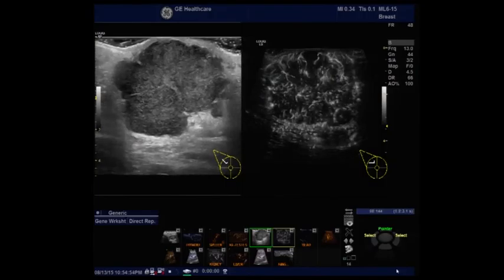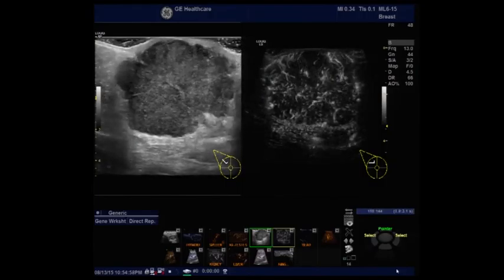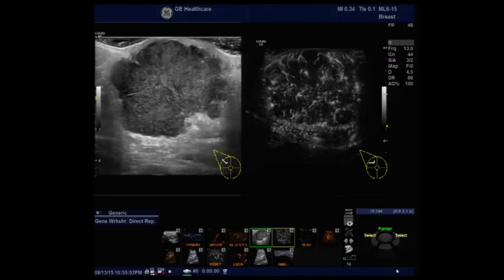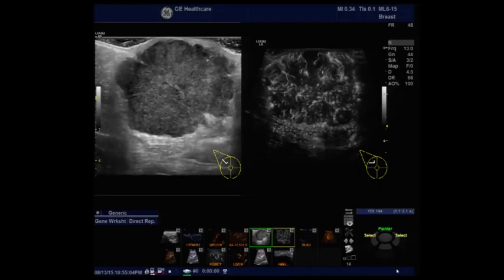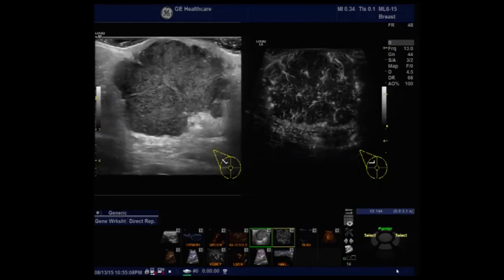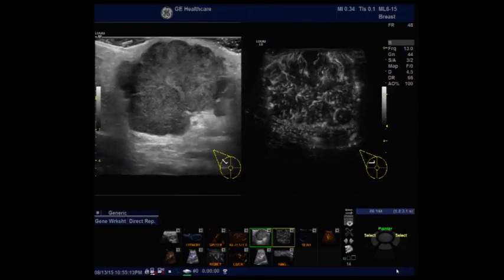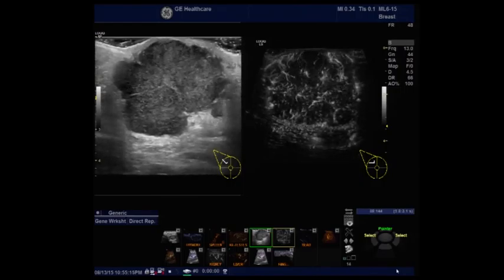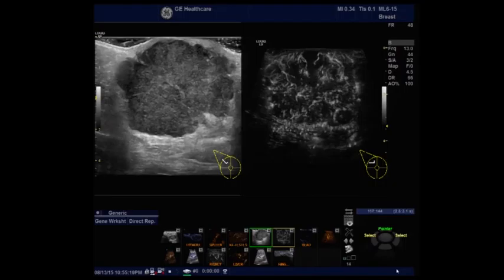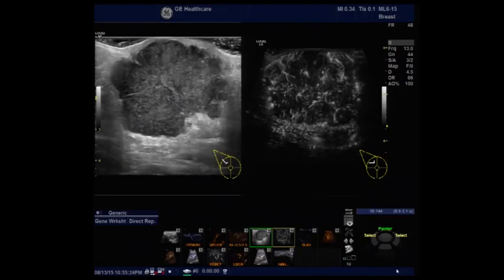When using B-mode imaging, tissue is visualized in the image and the blood flow is not normally visualized well due to the weak echo signals of the red blood cells. B-Flow is based on B-mode technology. In contrast to B-mode imaging, B-Flow essentially suppresses the tissue and enhances the weak signal echoes of the red blood cells, which gives us the ability to see small vessel perfusion and hemodynamics within larger vessels.